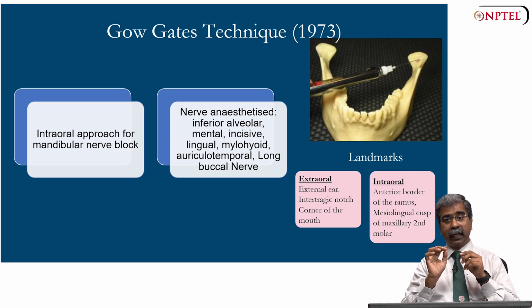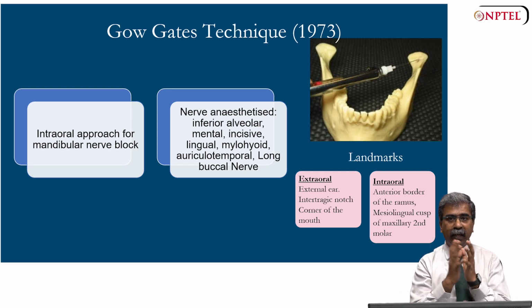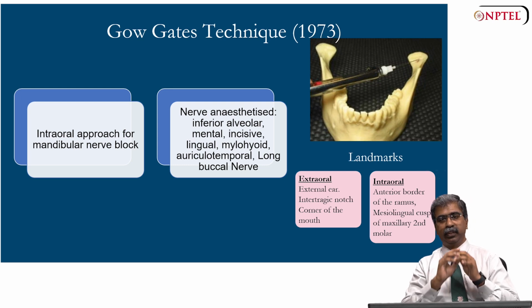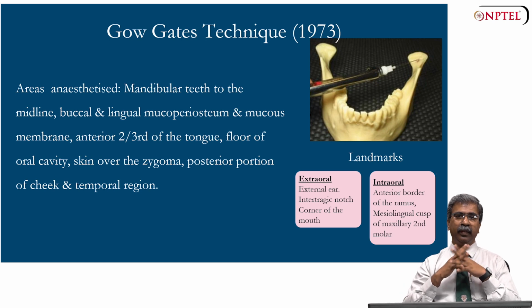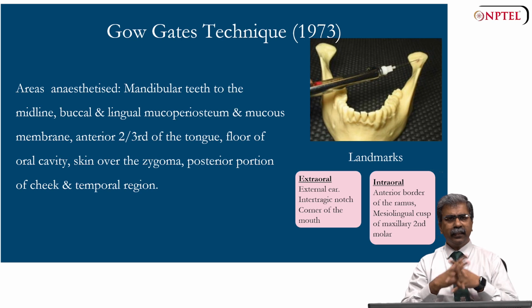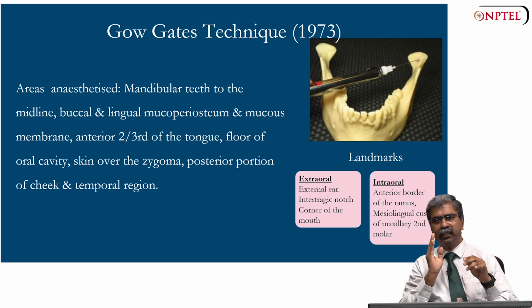It requires greater precision, but can cover all areas innervated by the mandibular nerve branches, making it ideal for extensive surgical procedures. So it's a very important technique. As you can see in the image, the point where you deposit the anesthetic solution, and the areas anesthetized are complete anesthesia of all teeth on the side of the block from molars to incisors.